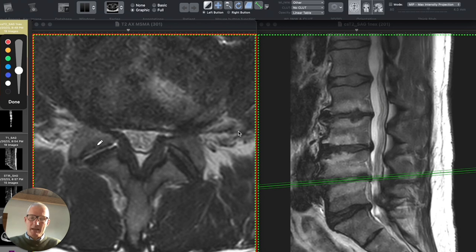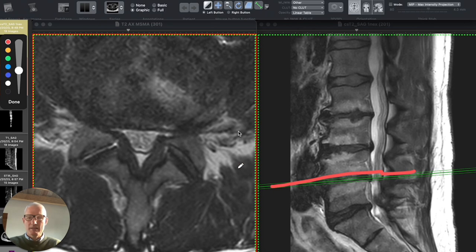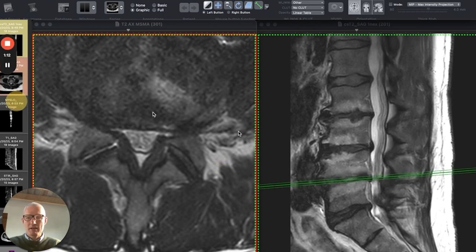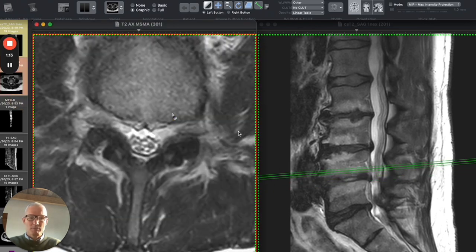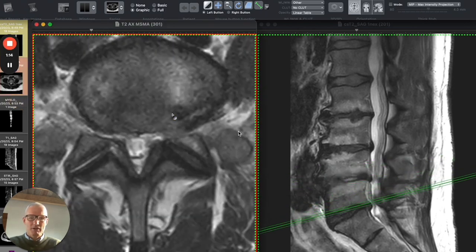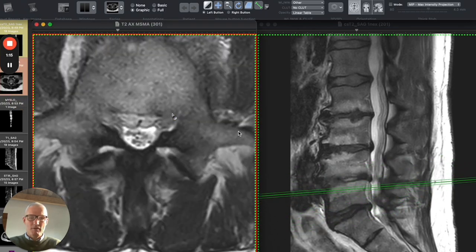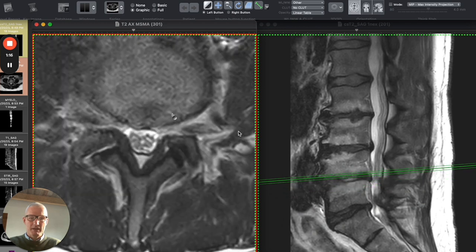And then this is an axial cross section over here on this side of the screen at the level of this green reference line. And when I'm over on this side of the screen and I scroll up and down, you'll see the reference line move up and down the spine.